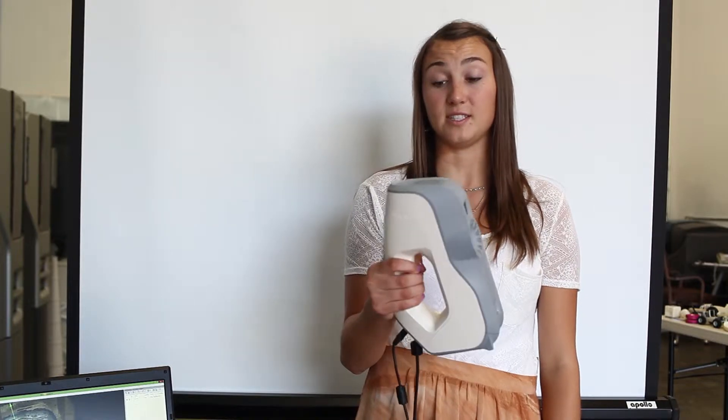Welcome to SimMed. Here we are introducing the Artec 3D scanner that we use to scan burn survivors' faces in order to eventually produce a burn mask that they will use during their recovery period.